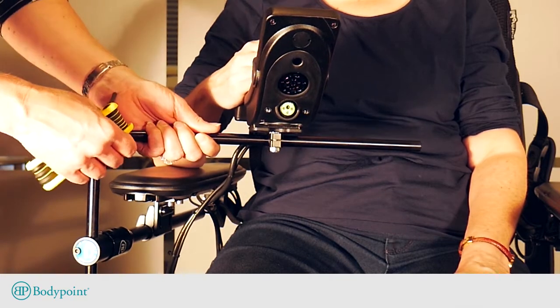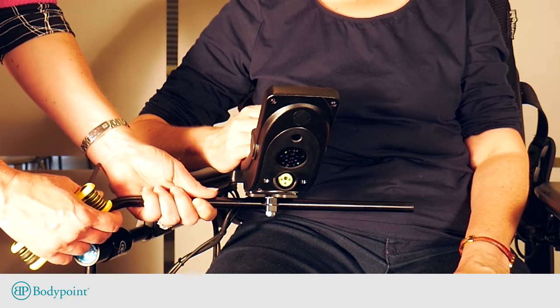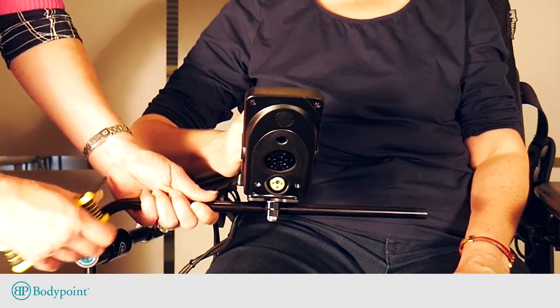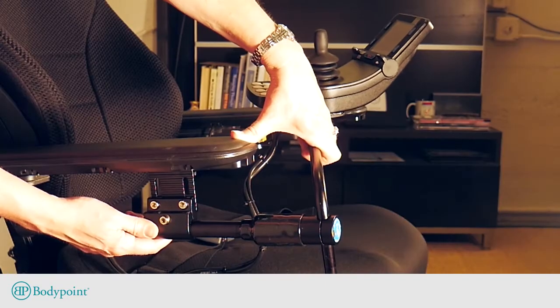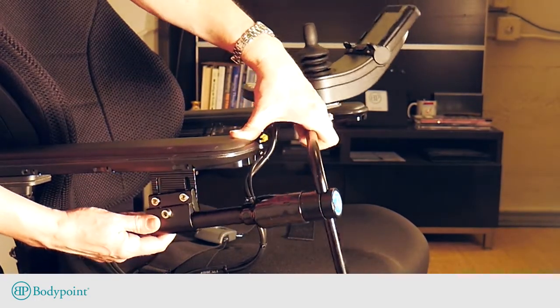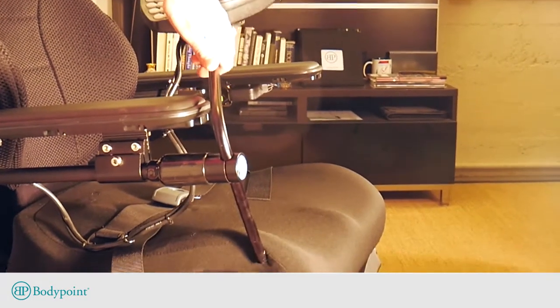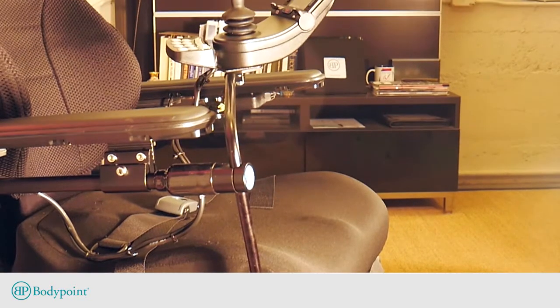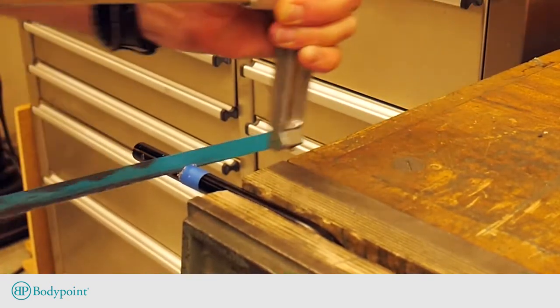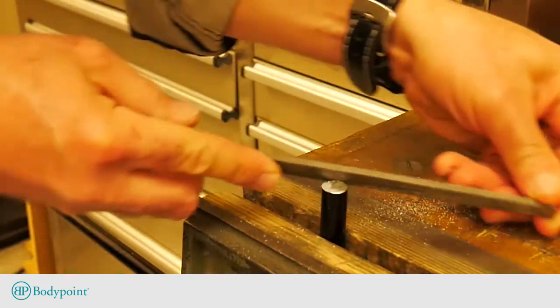Determine the best driving position for the user and consider their need for support under their elbow and palm. Fine-tune the height to allow them to comfortably grasp the joystick handle. Adjust the position of the rotating shaft, midline arm, and joystick adapter as needed. The mounting clamp under the armrest can be angled to offset any tilt in the armrest. Test this position and check for interference at the lower end of the L-shaped midline arm when the joystick is lifted and swung away. If there is interference, the arm can be shortened by marking it and cutting it with a hacksaw.